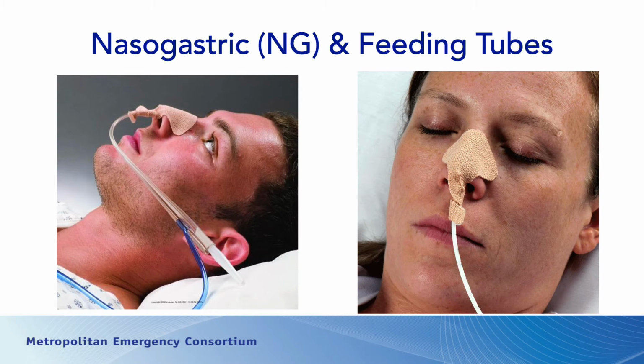First thing I want to talk about is nasogastric tube and feeding tubes. I think nasogastric tubes are things that you have seen. They are actually within your scope of practice. You're more likely to see, however, a feeding tube in place or a feeding tube that's having problems for the patients that you serve as an outpatient arena.